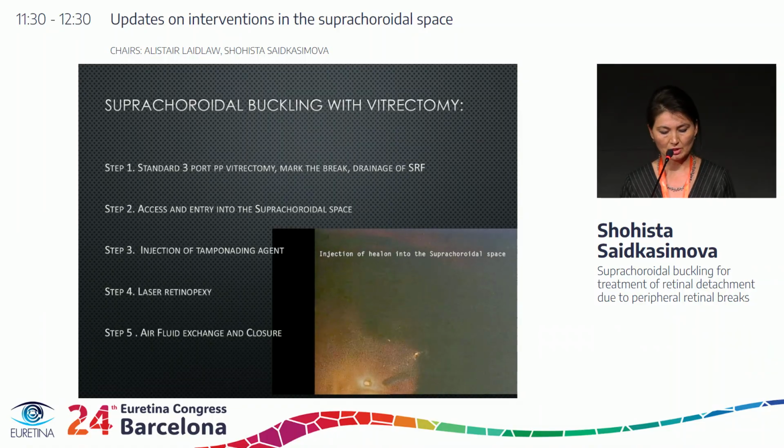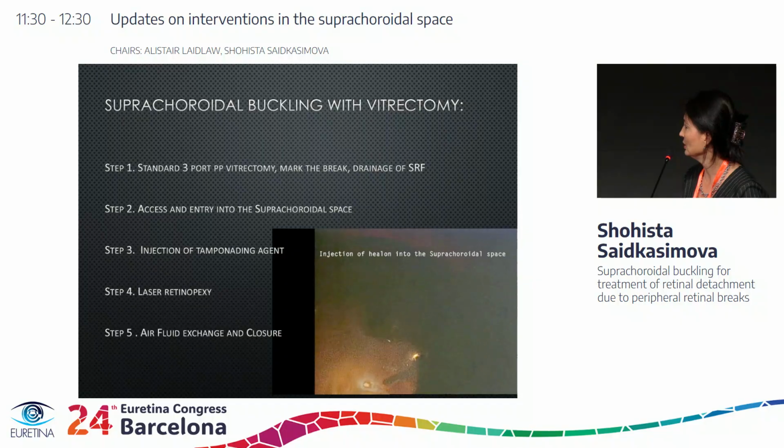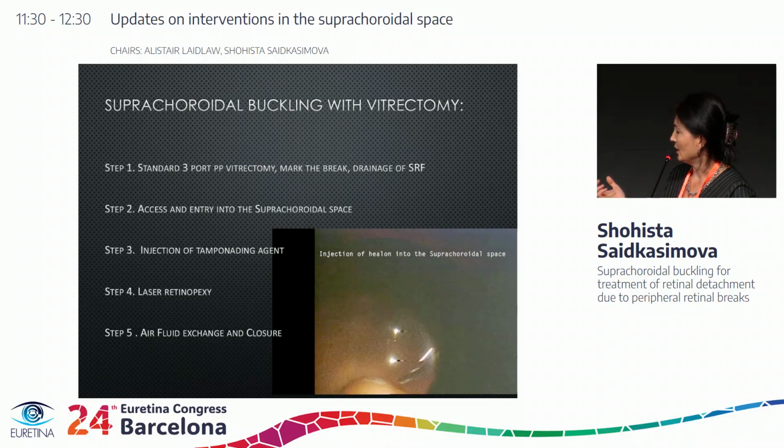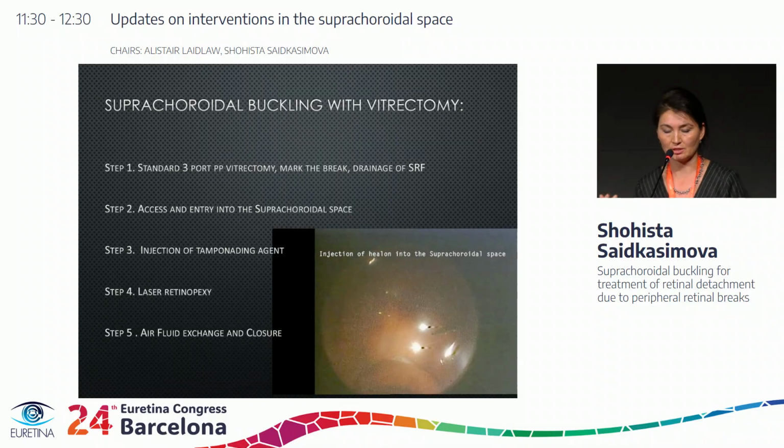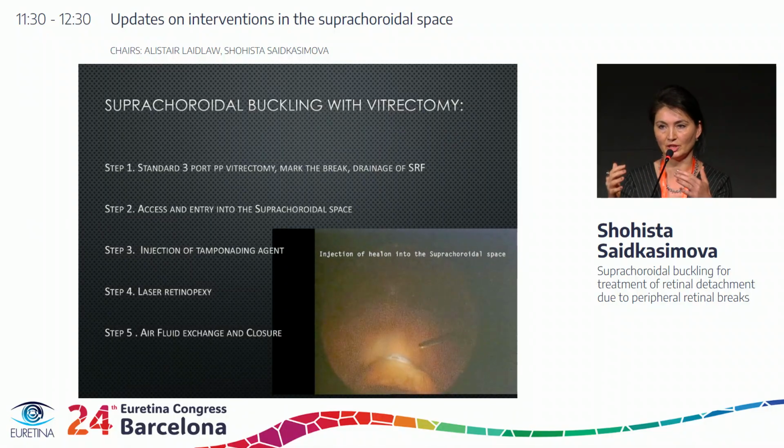So here you see we've placed the cannula, and now we're going to very slowly, under direct visualization, advance and inject and induce this nice buckling effect. The major advantage is that you can direct the cannula as convenient, and also you can judge by the height of the buckle as you need, so as to position the break on top of the hill if you wish.